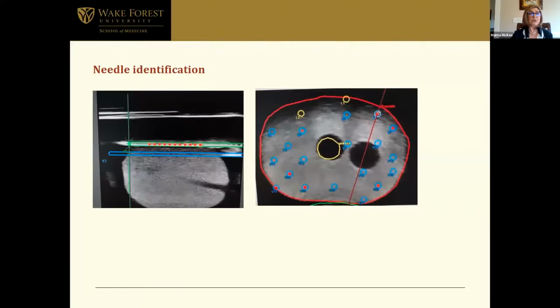Another method is to use the Pearl contouring tool, which is basically you're able to manipulate the diameter of a ring and reconstruct your urethra based on that. The minimum requirement that you would need for contouring is your PTV prostate, your urethra, and bladder, and some people would also basically draw rectum as well. So for our department, the 4 of them are always contoured: prostate, urethra, rectum, and bladder.